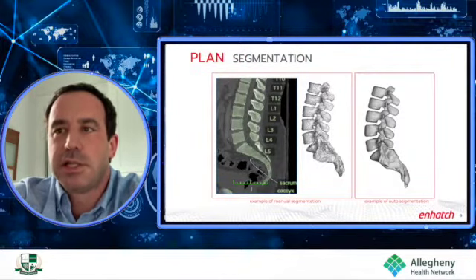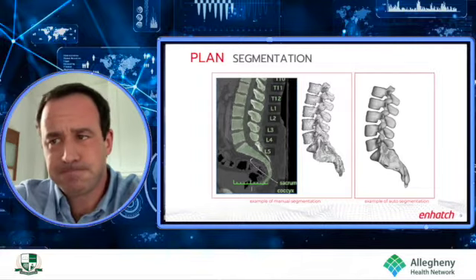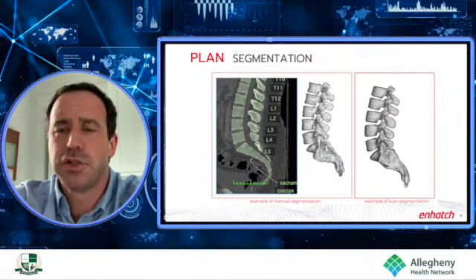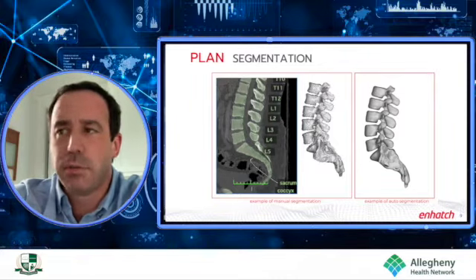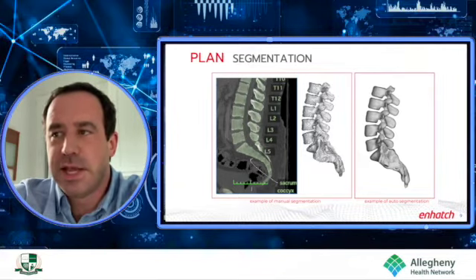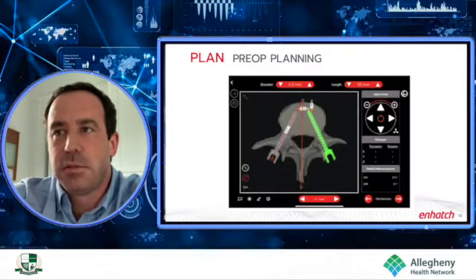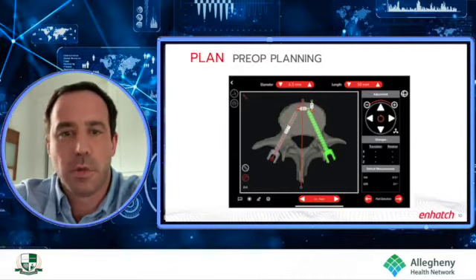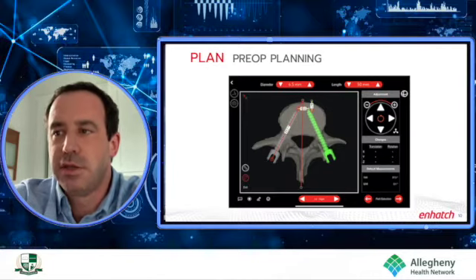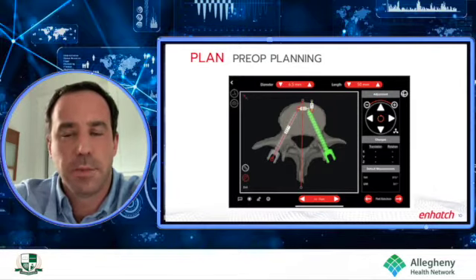This is a segmentation, a plan for a spinal fusion surgery. And you can see the level of detail that's created with auto segmentation of this imaging using artificial intelligence, using an AI algorithm versus what's done manually. And equally or more important, this is done much, much faster. So producing this level of detail, this segmentation can be done extremely quickly with AI. You're again seeing preoperative planning of spinal deformity correction with this technology, and then carrying through into the OR where you're correlating with the aforementioned imaging.